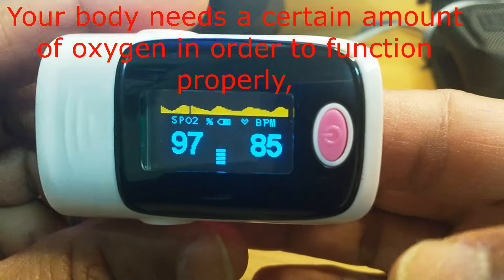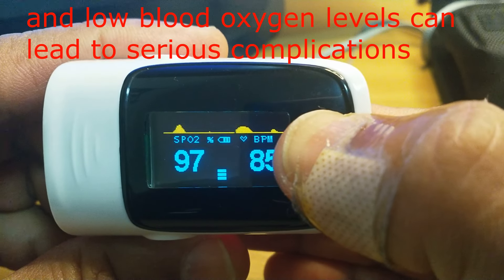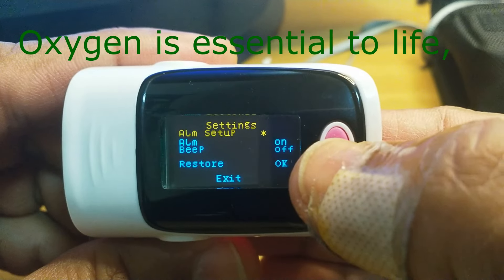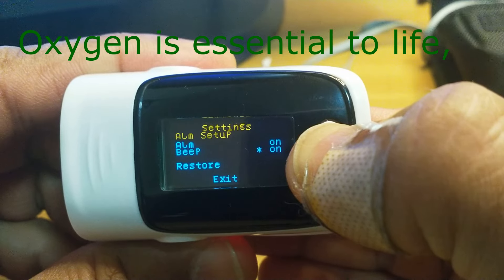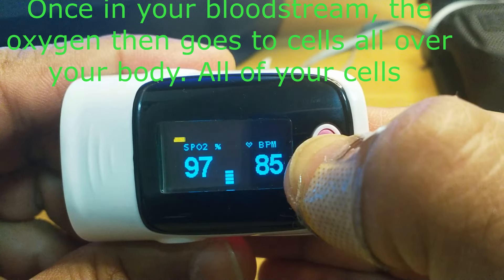Now it is having some secret functions that I will show you. Just continuously press this button. The first setting is the alarm setup — alarm on, beep on and off. Now continuously press here.